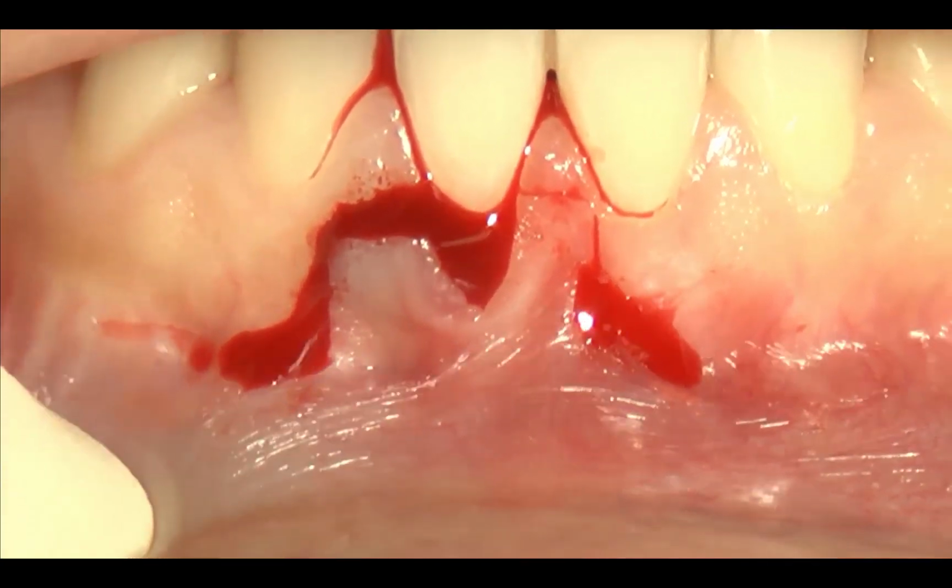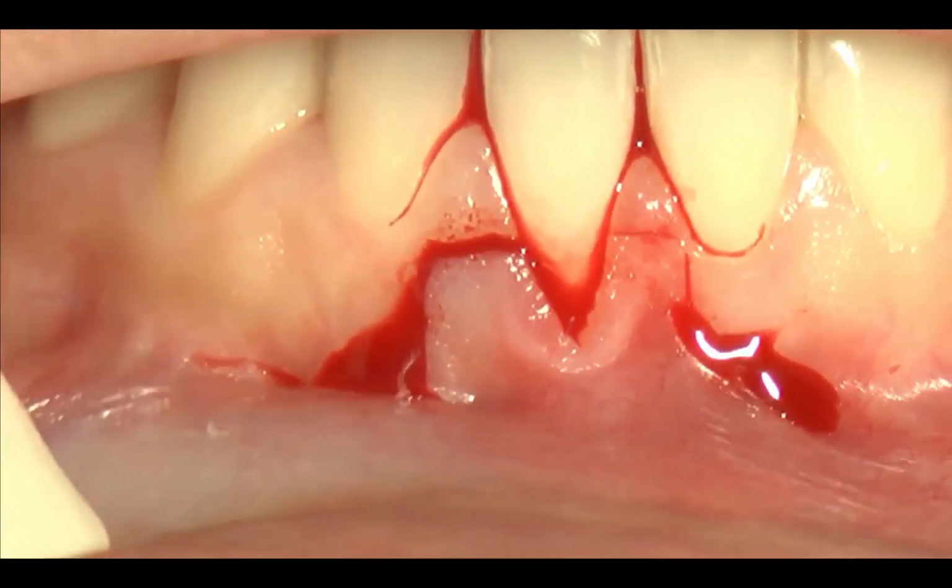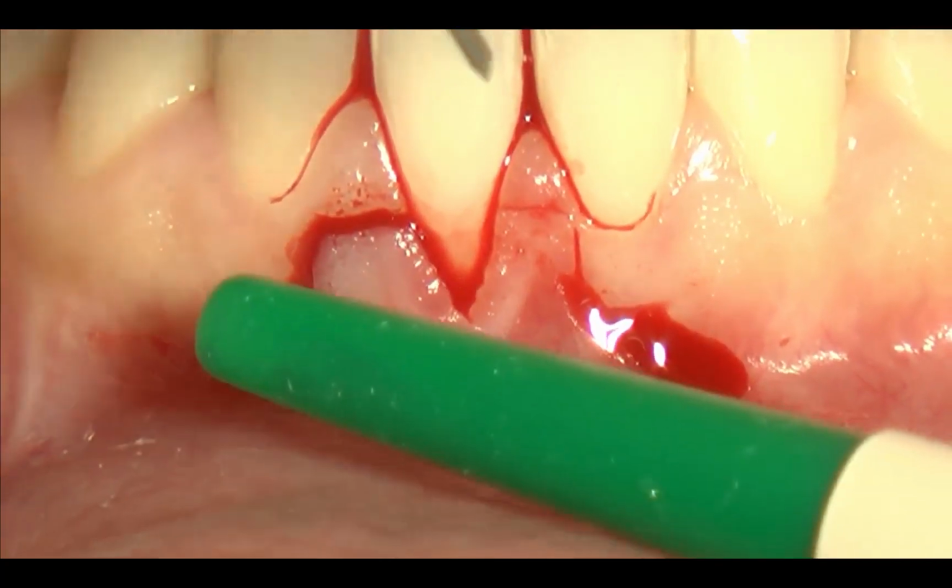Now we have to make the second split thickness surgical papilla, which is much more difficult because of the presence of the frenulum.